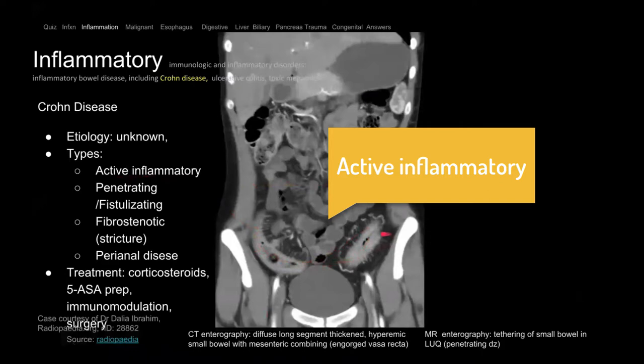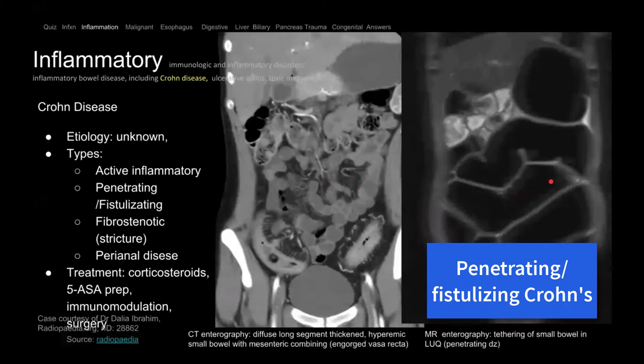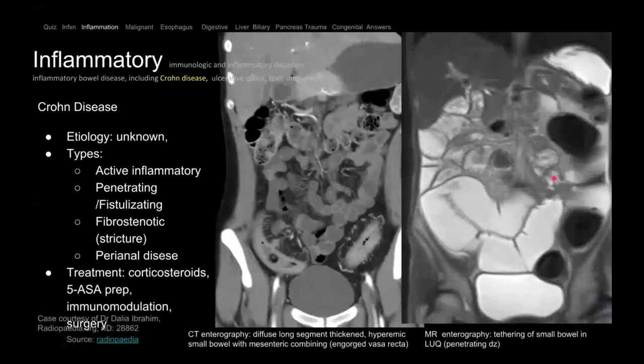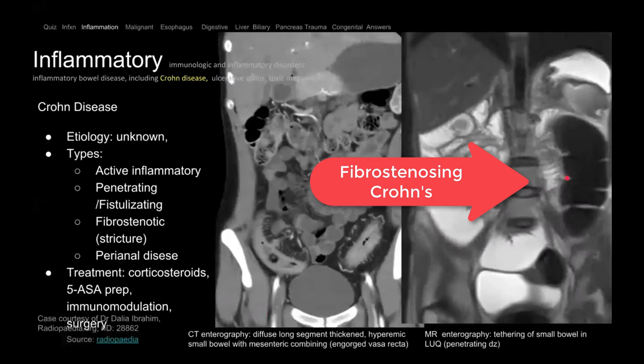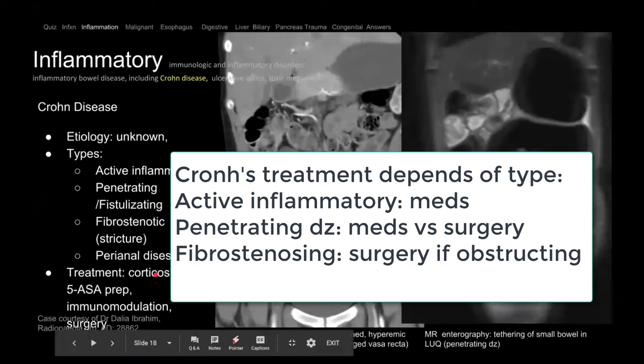Here is an MRI enterography — you can do the same thing with MRI, which is better. Several bowel loops are getting tethered — this is penetrating disease where inflammation causes bowel to become tethered to one point. Eventually it can develop strictures — a segment of bowel that's really narrow. After a while the inflammation settles down, scars down, becomes a stenotic stricture causing bowel obstruction. Treatment includes biologic agents, steroids, and in some cases surgery.